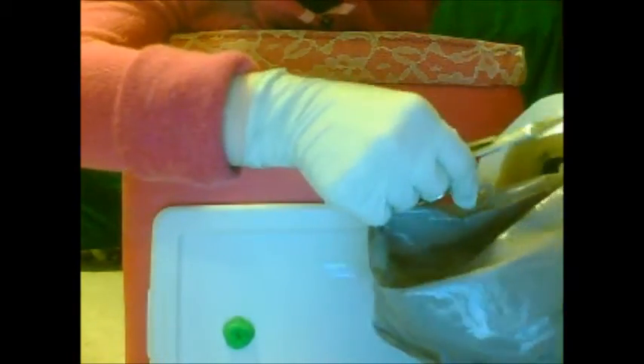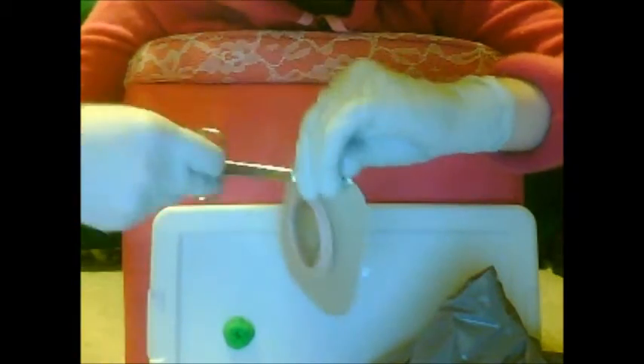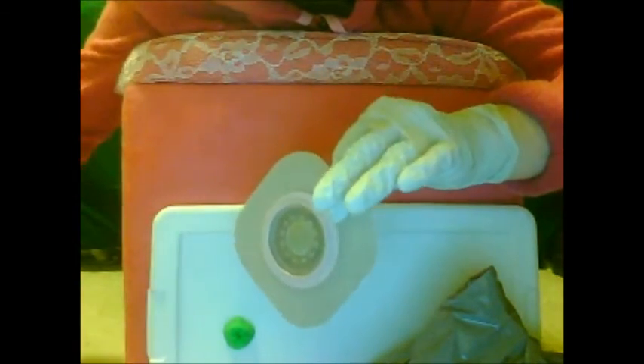The first time I cut it, I cut it so terribly. And you just dispose of that little piece — and voila! It'll go on facing out, but first put the scissors down so I don't stab myself in the eye.